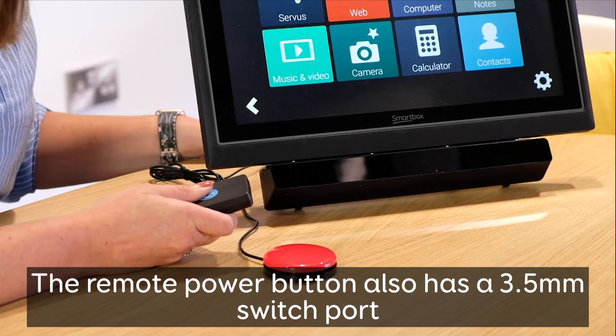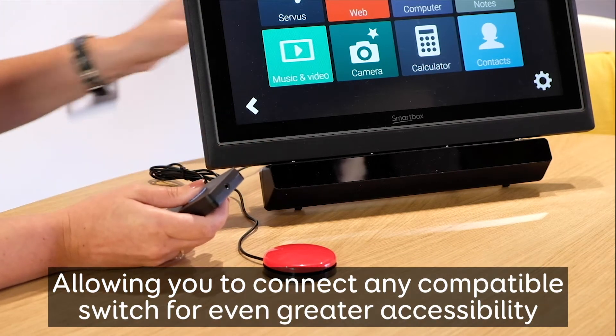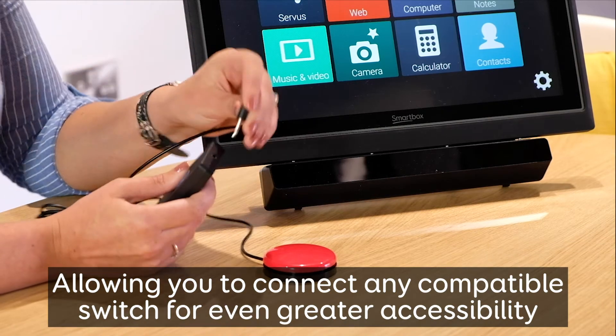The remote power button also has a 3.5mm switch port, allowing you to connect any compatible switch for even greater accessibility.